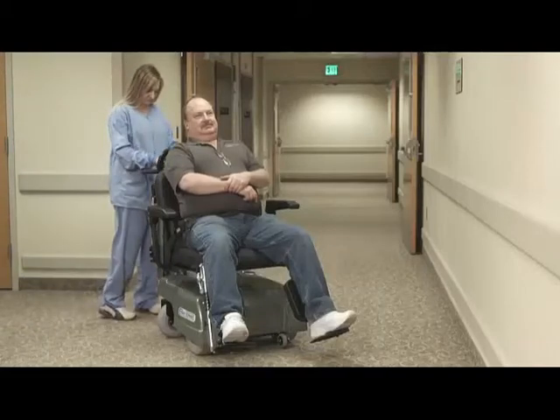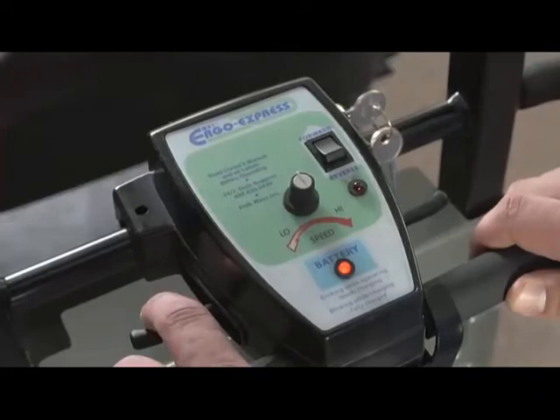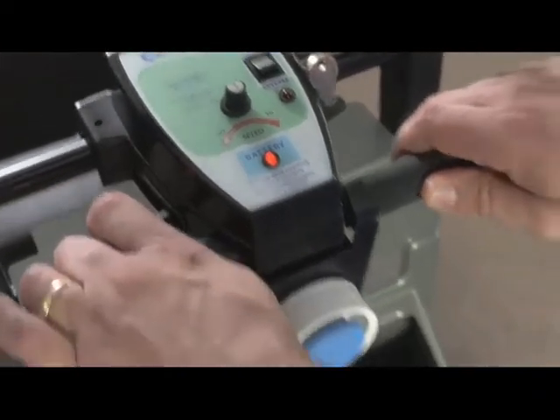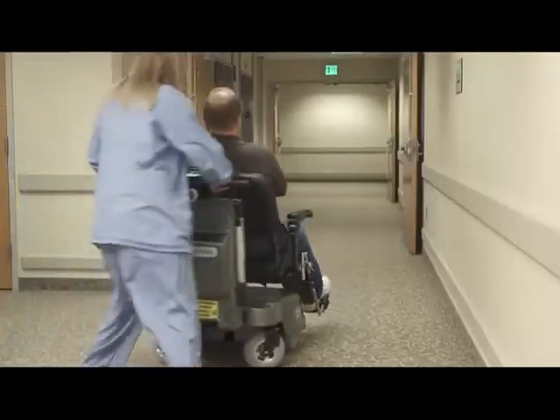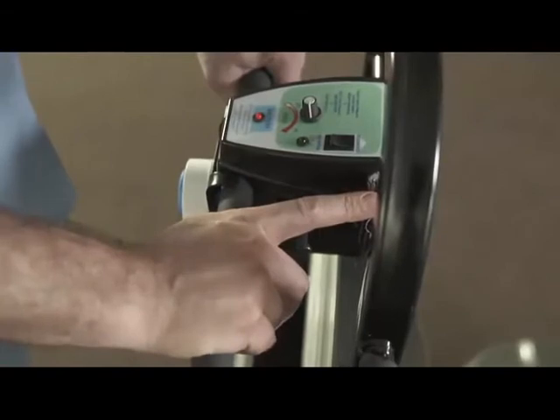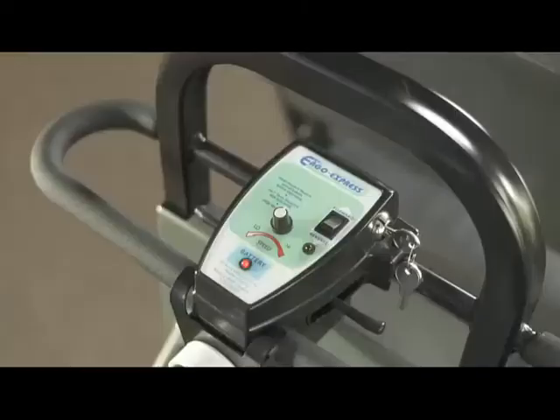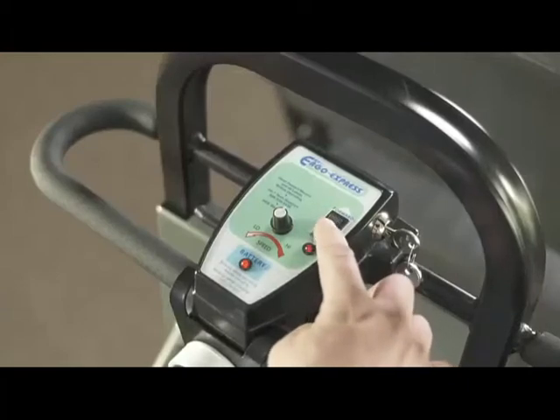Position yourself behind the control panel with both hands on the handle grips. You'll use the fingers from one hand to operate the throttle lever. Remember to gently engage the lever to avoid starting too quickly. Once moving, you can release the lever and the PTC will come to a stop approximately one second after the release.